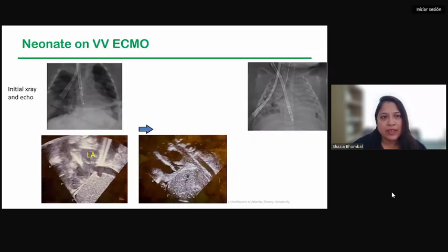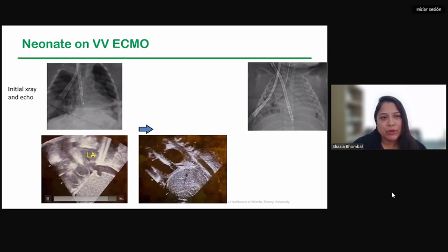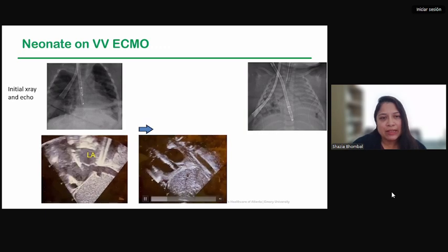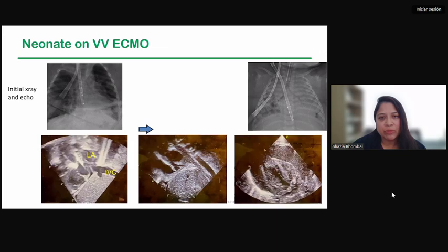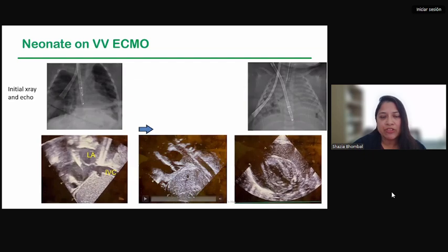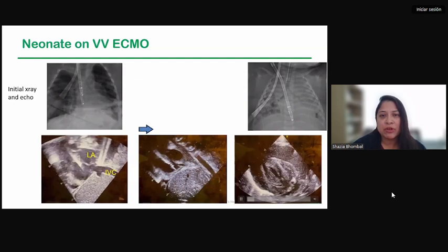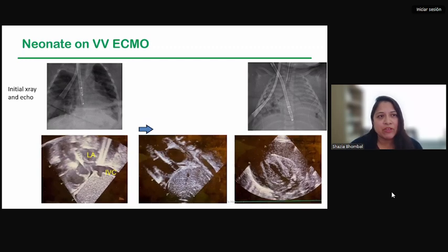Now, more advanced, thinking about our ECMO patients. This is a patient on VV ECMO, and this is the cannula. It's in the right atrium in here, in a reasonable position based on echo. It looks a little bit deep here, and you can see these very well by ultrasound compared to X-ray, and it was actually very deep by X-ray as well. And this one, unfortunately, did develop a big pericardial effusion. So by looking at these cannula positions, we can adjust in real time. Can we avoid some of our complications? Can using POCUS really help us in management of this patient population?